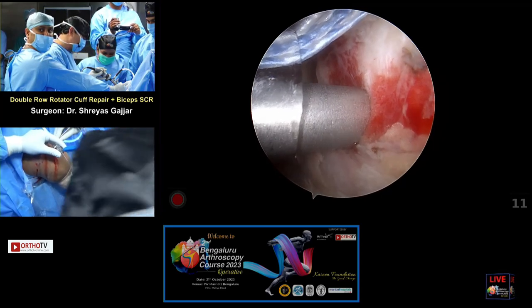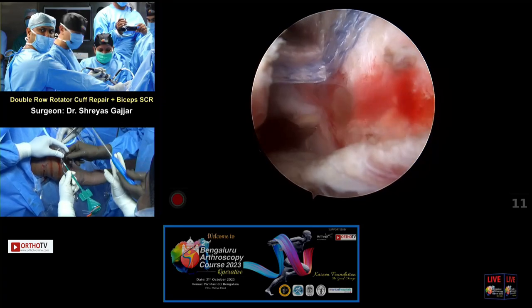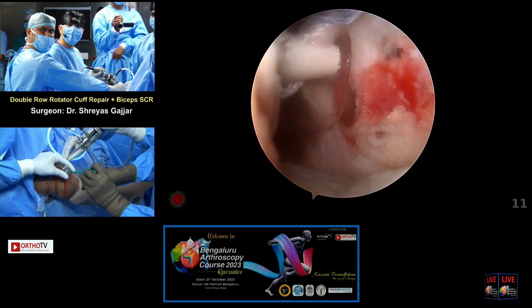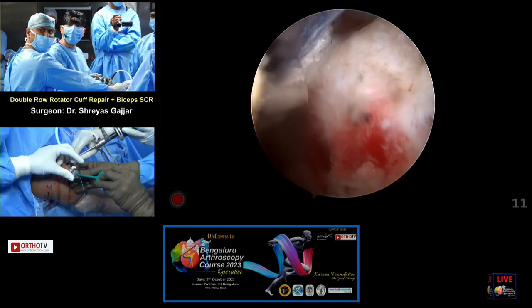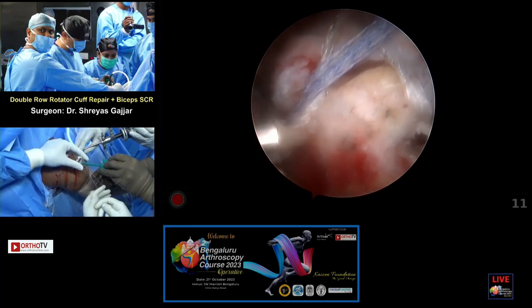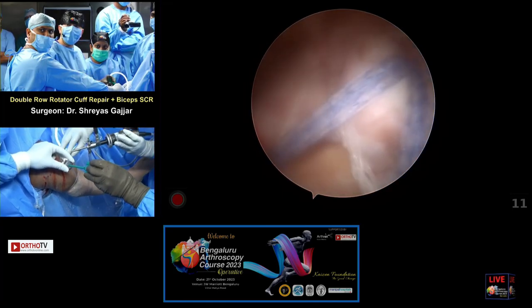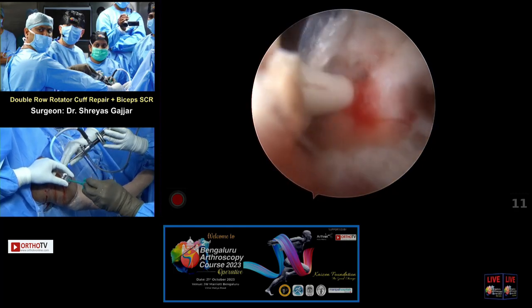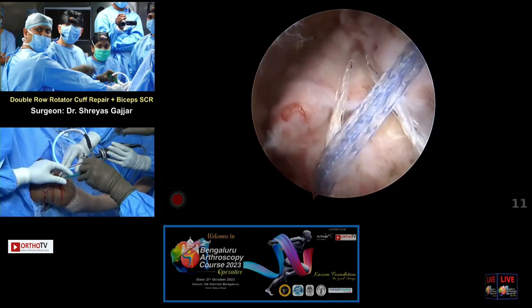Okay, hold this, please. Hold the anchor, thank you. Okay, so I'll just insert this till the eyelet, then remove the mosquito, relax on the cannula, thank you. The assistant gives me the two sutures, and I'll take the slack off, one and then the second, like so. And then come down, Rohit, let me have a look. So come down on the hole. Yeah, come down on the hole. And that's it. So can I have the hammer, please?